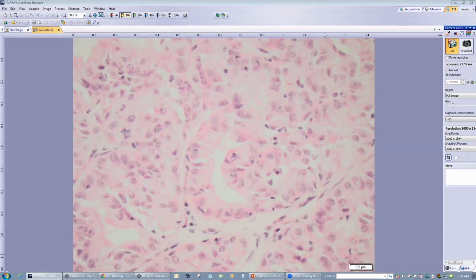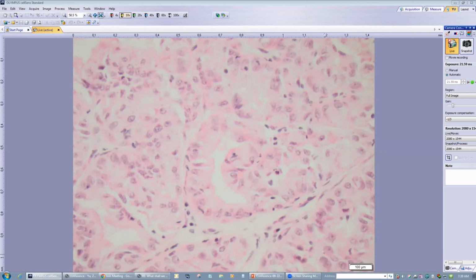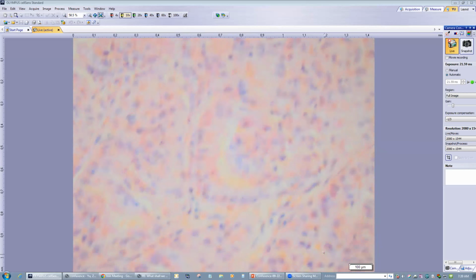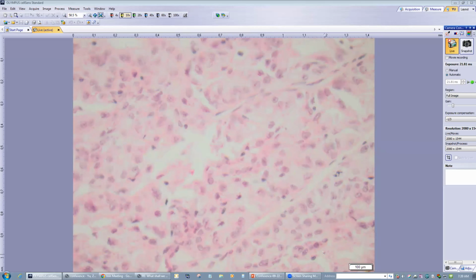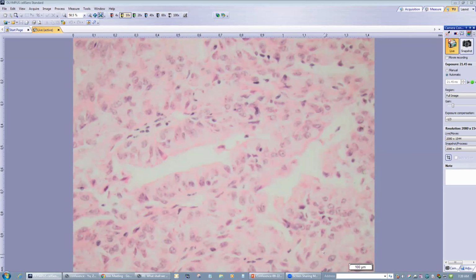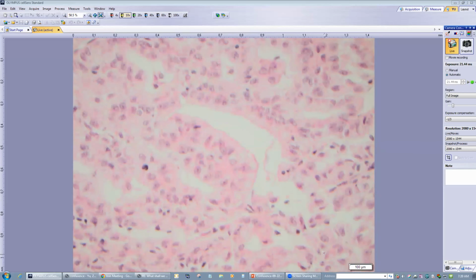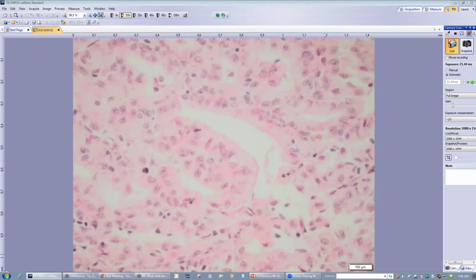So this tumor, when we do immunostaining, I remember it's cytokeratin negative, CK7 negative. But a few other melanocytic markers, HMB45, focally positive. So with this history, with this morphology, voluminous cytoplasm, prominent nucleoli, we did the TFE3 gene mutation. It is positive for TFE3 gene mutation.